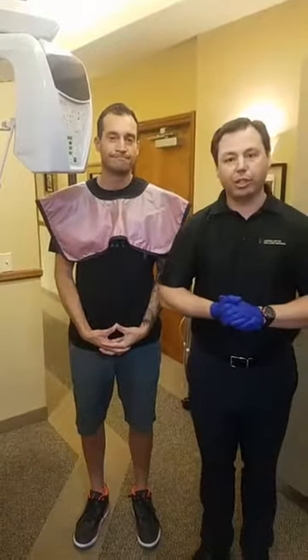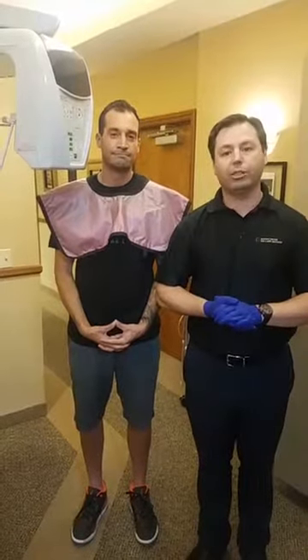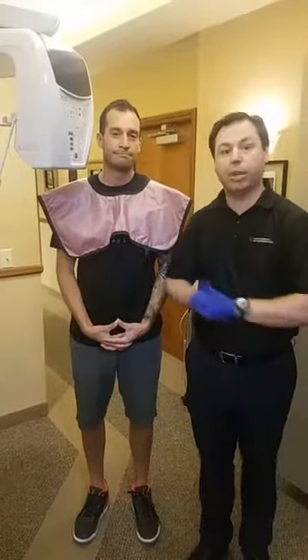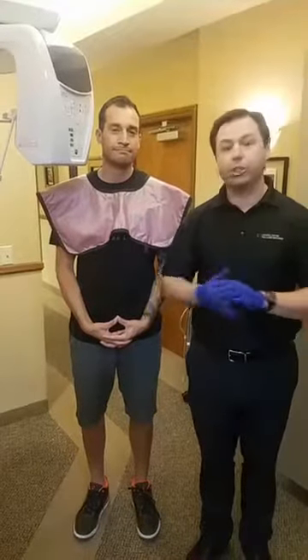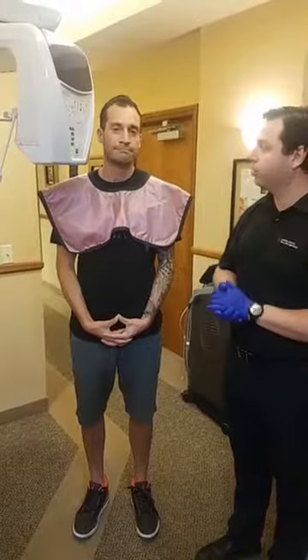And David has agreed to do a quick little show and tell of how we utilize the technology here at the office to not only do your dentistry, but specifically so that we know the particular patient in person and how we actually gather the information for this particular procedure, which will be an implant. David, do we have your permission to film this and take the photo?